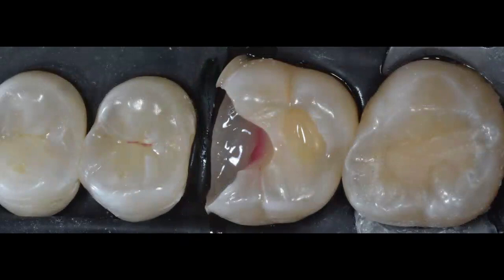And all I'm trying to accomplish is to bring that margin a millimeter above the rubber dam, because what I want to try to accomplish now is just go ahead and use a sectional matrix so that I can reestablish the contact. Now here, I have not yet reestablished my proximal walls. So I haven't used that PVS yet. All I have accomplished here is just my deep margin elevation.